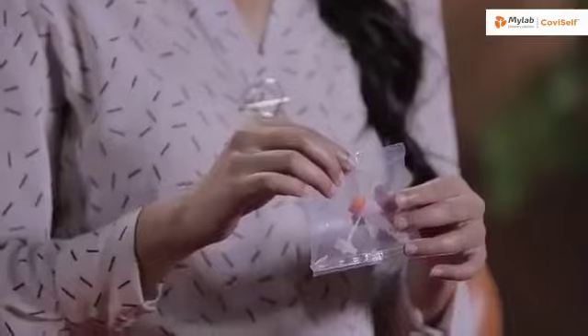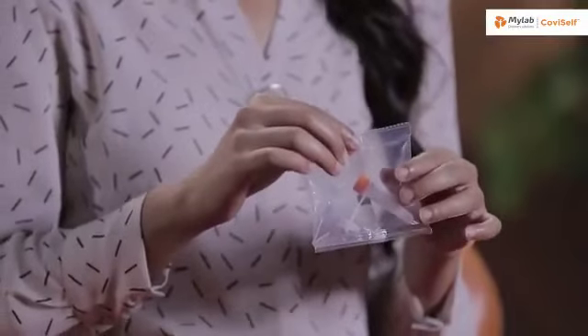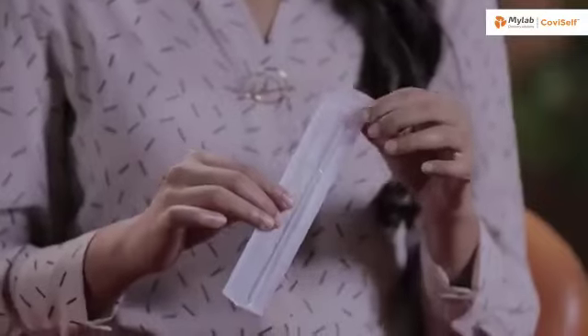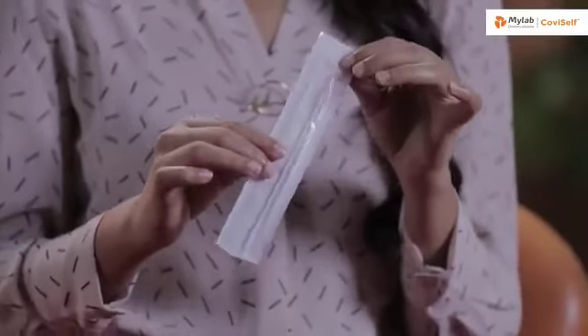This is the instruction manual. This is a pre-filled extraction tube. This is a sterile nasal swab.